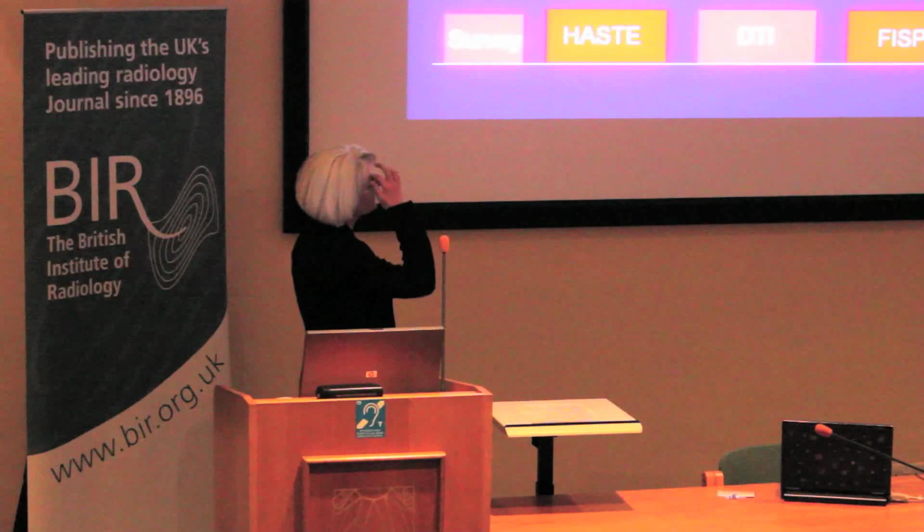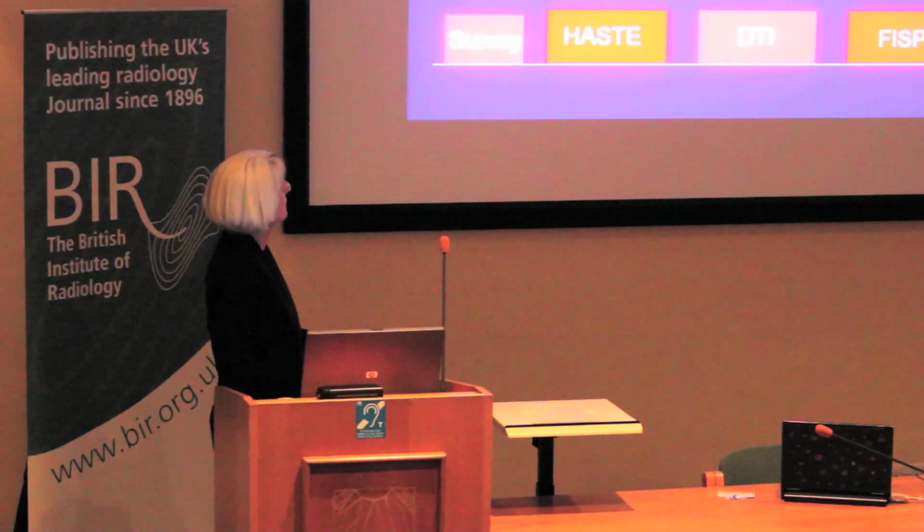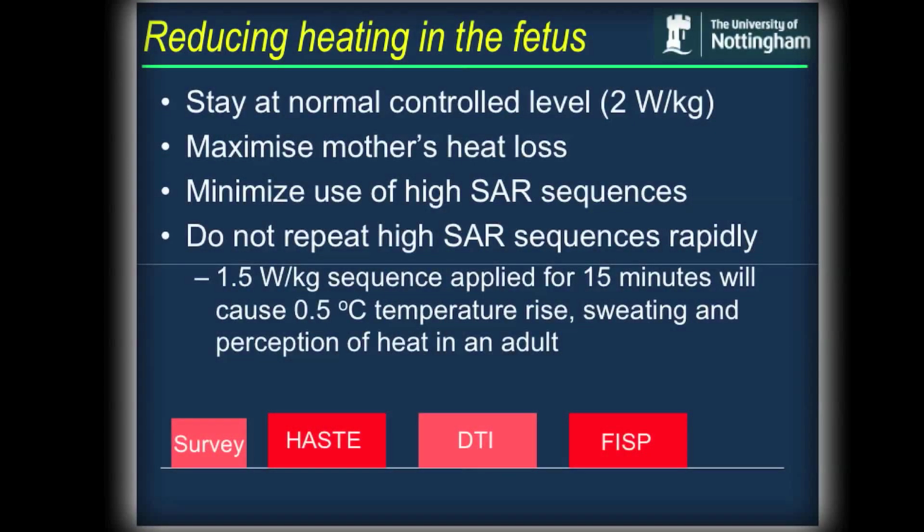So what can we do to avoid this? Well, certainly in Nottingham we stayed below 2 watts per kilogram, and I think it would be quite hard to justify going above it at the current moment. We maximise mother's heat loss. I say Nottingham, I should say Nottingham MR Centre. In the research environment, it's slightly different. We minimise the use of high SAR sequences, but you need to use them to get good image quality.